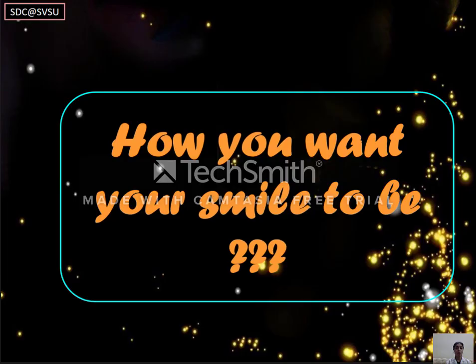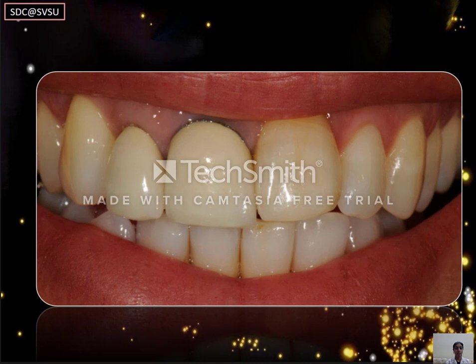Before starting with my seminar, I would like to ask you all a question. How do you want your smile to be? Like this, in which there is metal show through from the porcelain fused to metal restoration? Or like this, which is a more aesthetic and pleasing smile to look at?